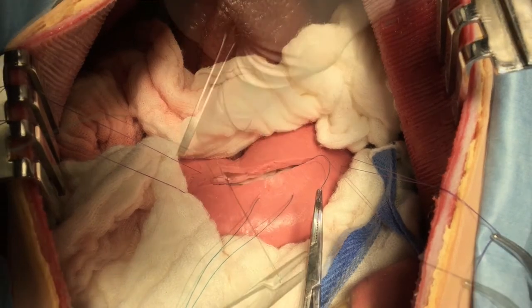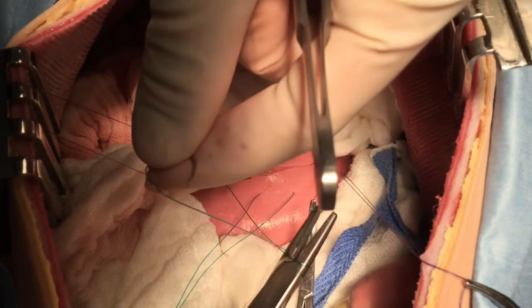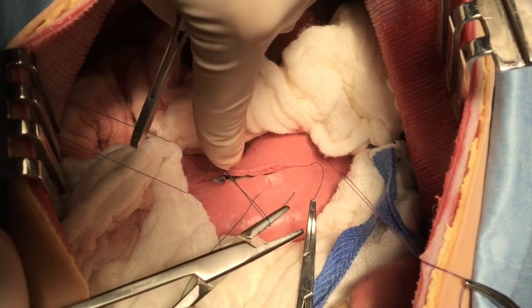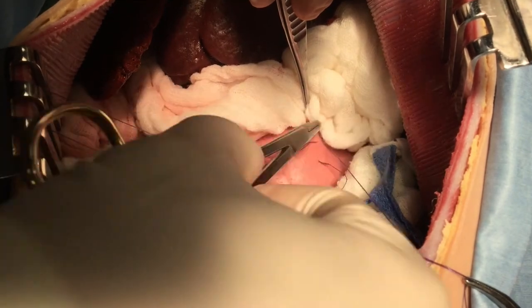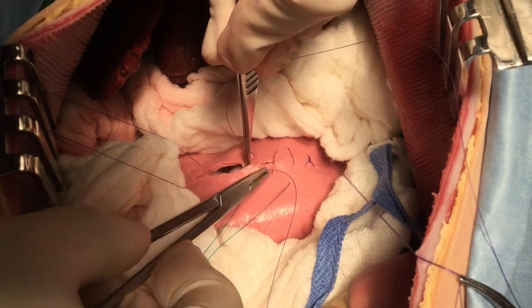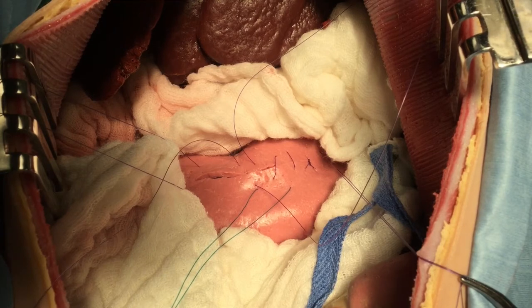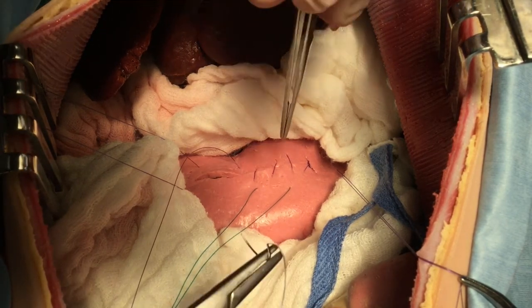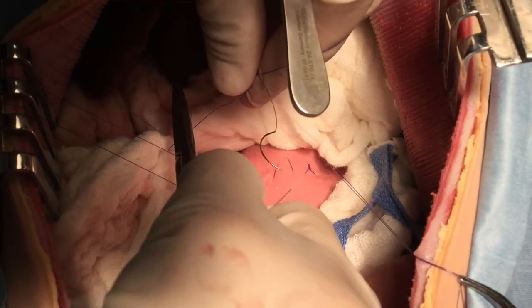While you are applying this line, be sure that the cut margins are inverting well, thereby creating a nice secure barrier from the lumen. After closure of the mucosal sub-mucosal layer, the seromuscular layer is then carefully opposed using 2-0 PDS or some other monofilament absorbable suture. Here, we are just using a simple continuous pattern.